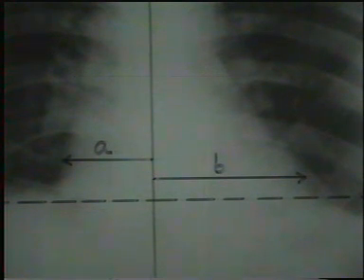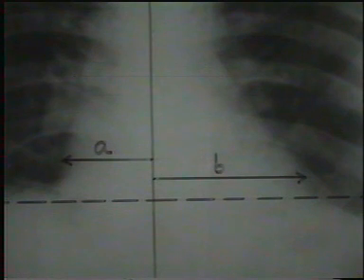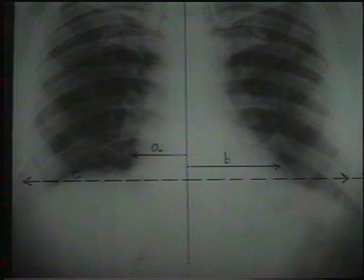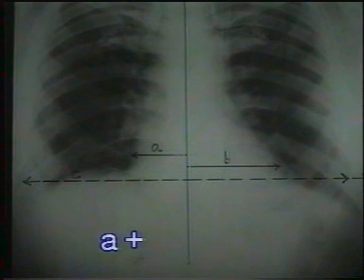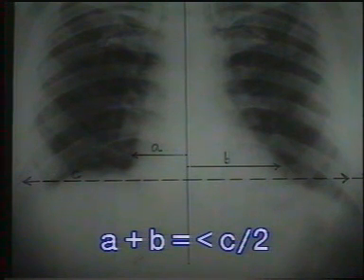To measure the cardiothoracic ratio, draw a vertical line through the center of the spine. Draw lines A and B perpendicular from this line to the maximum widths of the right and left heart borders. A plus B gives the maximum transverse diameter of the heart. It should be less than half of the maximum transverse diameter of the chest, i.e. C, the transverse line joining the inner borders of the ribs at the widest portion of the chest. We will study the details of the heart shadow in a later section.